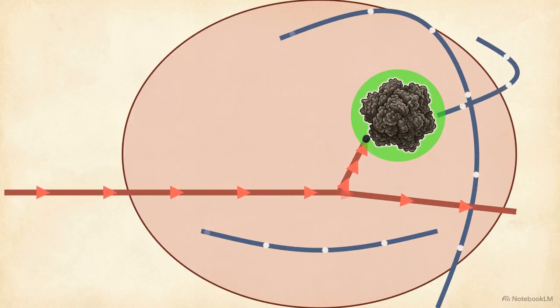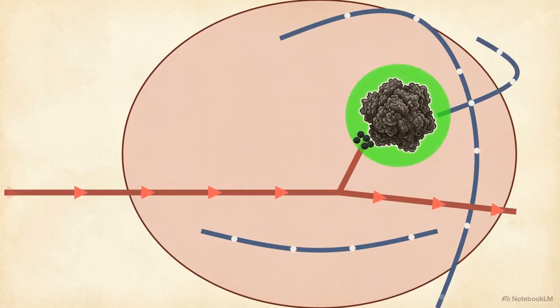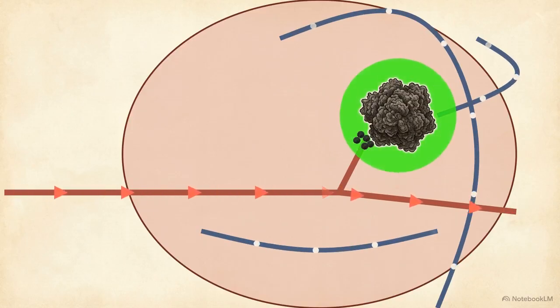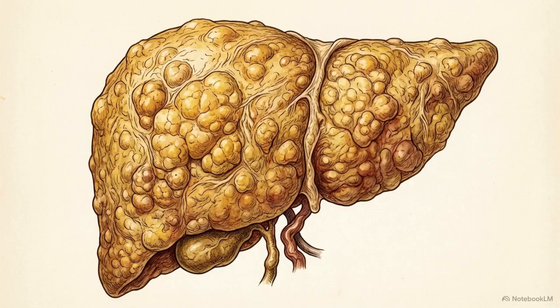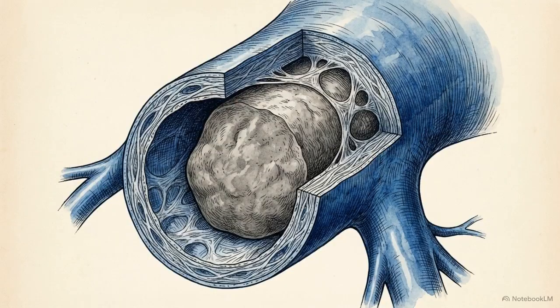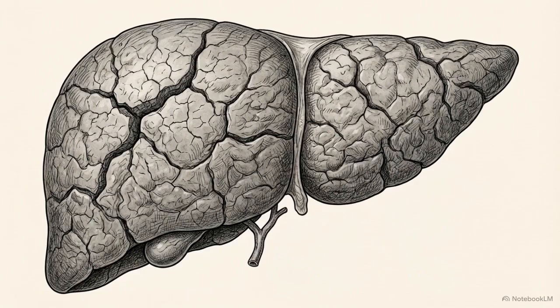Immediately following the oil, the physician deploys tiny physical particles into the artery. This blocks the outflow, slowing down the washout and trapping the toxic payload inside the tumor for a prolonged period. This aggressive, localized attack relies on the health of the remaining liver. Therefore, decompensated liver failure, where the organ is already failing to perform its baseline functions, is an absolute contraindication for TACE. Similarly, if a patient has portal vein thrombosis, a blockage of the primary venous supply, performing TACE becomes highly dangerous. Shutting down the arterial supply when the venous backup is already offline guarantees total liver infarction.